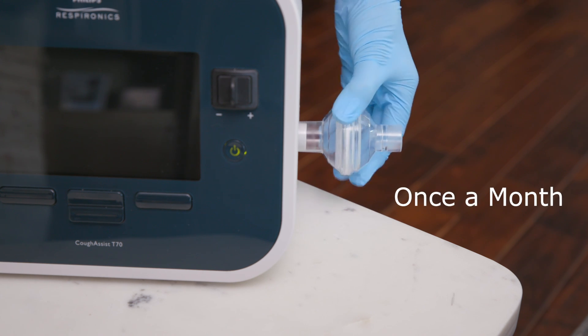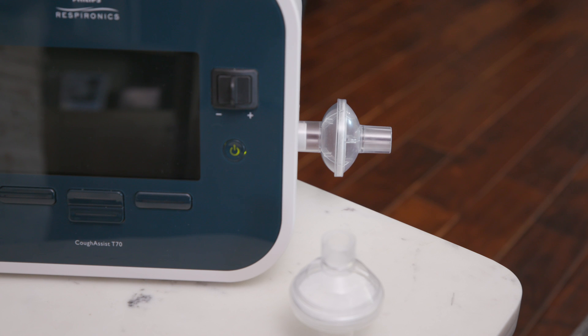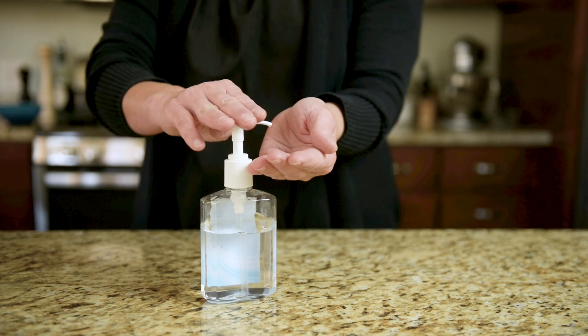Replace the filter on the cough assist device once a month, or sooner if it is visibly dirty. After finishing therapy and cleaning the supplies, remove the non-sterile gloves and clean your hands.